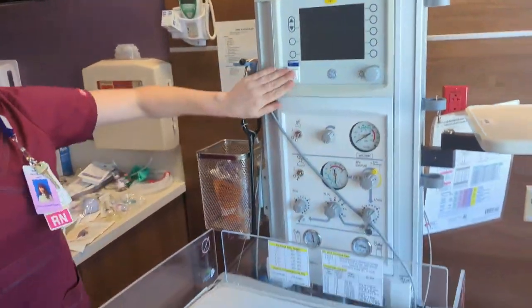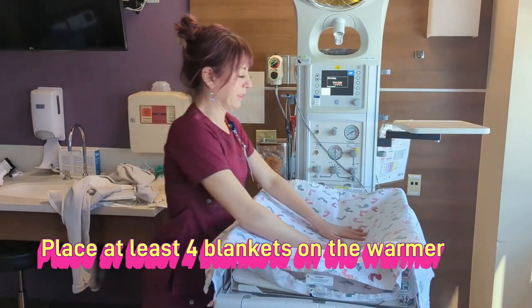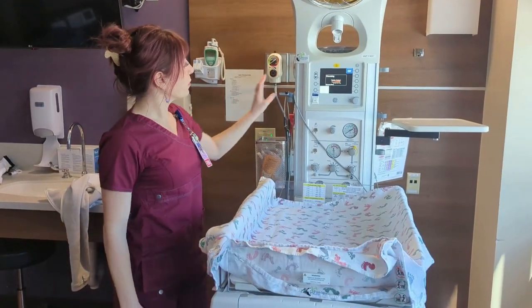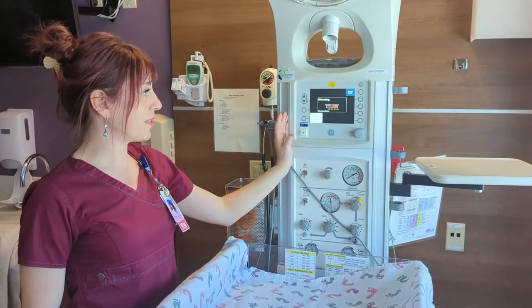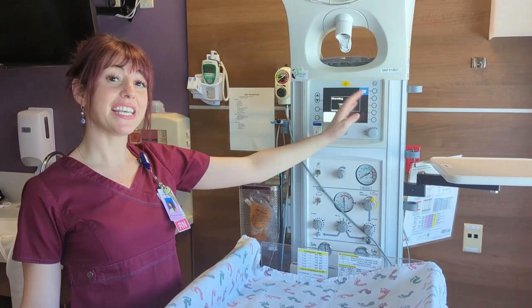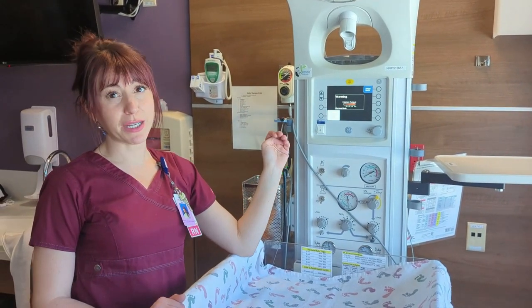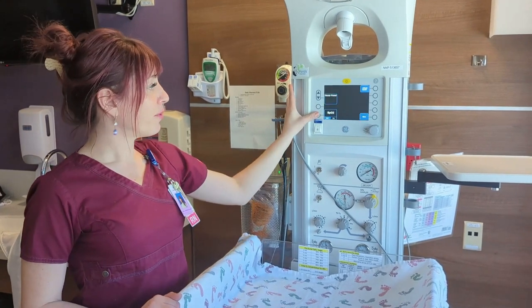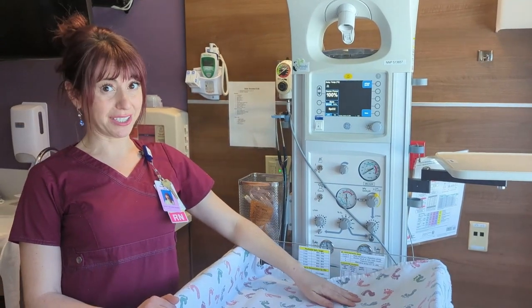Let's turn this on. If we're preparing for an imminent delivery, on the Admit Baby screen it will warm up to 100% in seven minutes. Then it goes back down to 50% and we can leave it here if we're not expecting our baby right away. But if we are expecting our baby, we'll hit Admit and keep our heat at 100%.